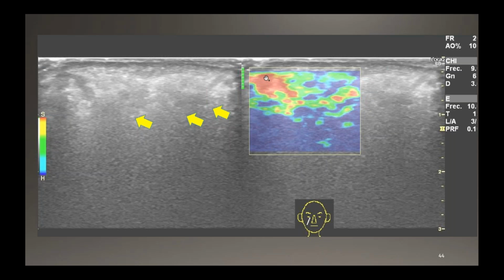Sometimes they are quite invisible, and you can detect them with elastography, which is useful to detect this subclinical filler in B mode, let's say. Here, acrylamide or hyaluronic acid vacuoles inside the silicone oil implant that this patient had.